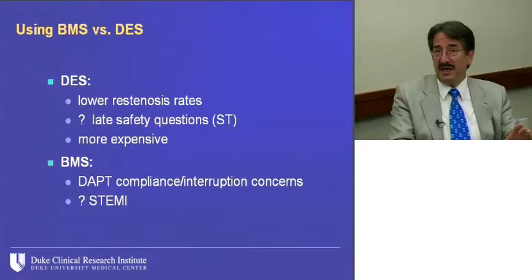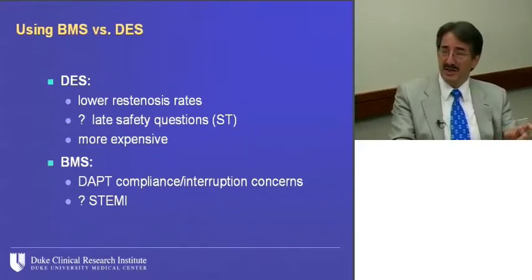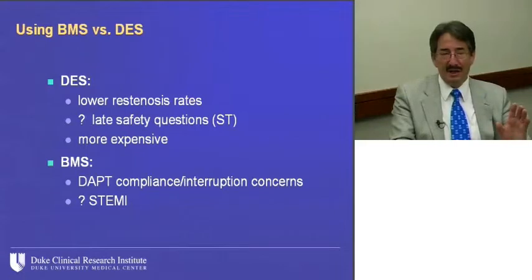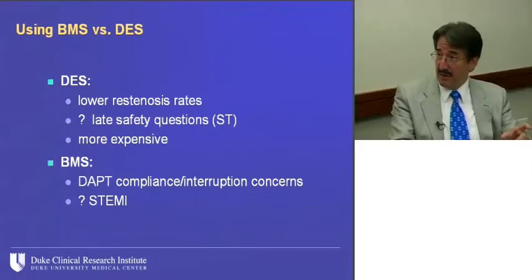And then in the STEMI setting, I think the substrate of a STEMI is still, although HORIZONS has been a huge step toward that, it's going to be a while before we have a 5-year outcome or enough patients to understand the 0.6% per year hazard rate. So I think the question in acute STEMI, where you can't screen the patient as thoroughly because time is muscle, you're moving toward the lab, that at least in the U.S., STEMI, I think, is still at least about 50% bare-metal, or around that number.